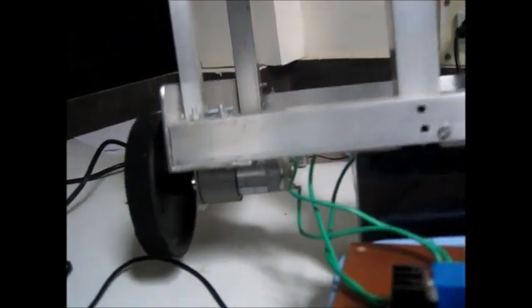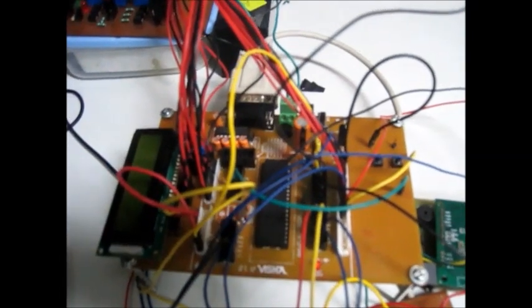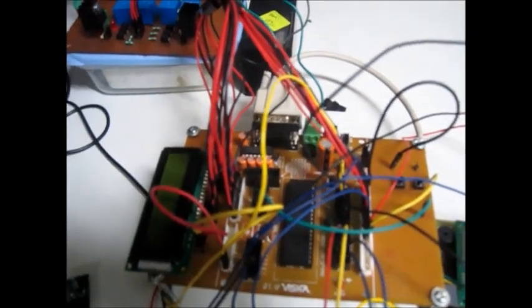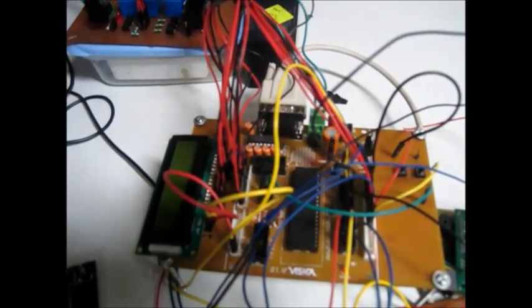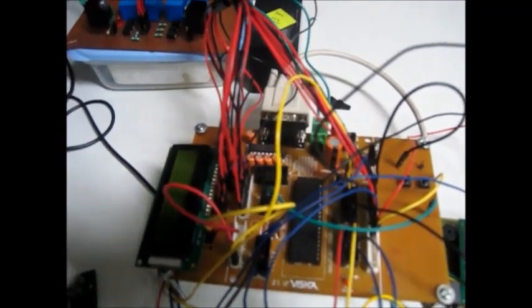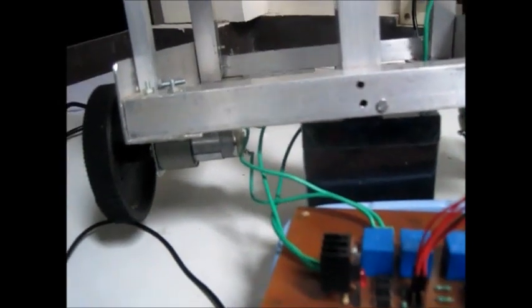When the speech command is recognized, a sine wave of a particular frequency is generated at the line out of the C6713 DSK. This sine wave is then fed to the analog to digital converter of the ATmega16 microcontroller. For example, when the right command is spoken, a sine wave of 12 kHz is generated at the line out of the C6713 DSK and fed to the ADC. Depending on the digital value obtained, the enable signal is generated by the microcontroller and given to the motor driving circuit, which in turn drives the motor in the appropriate direction.